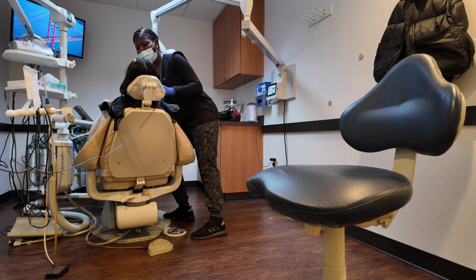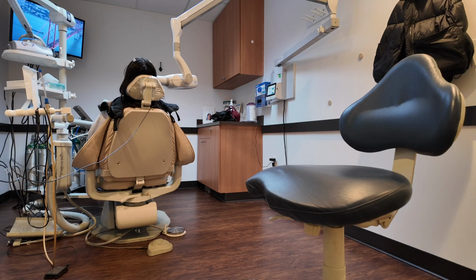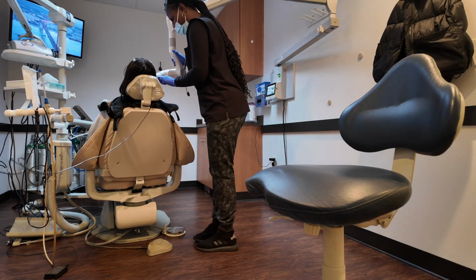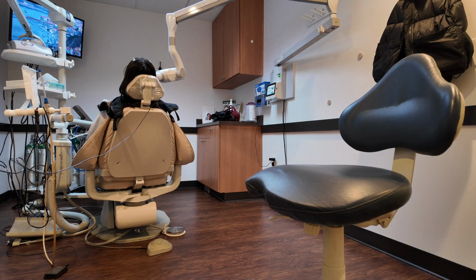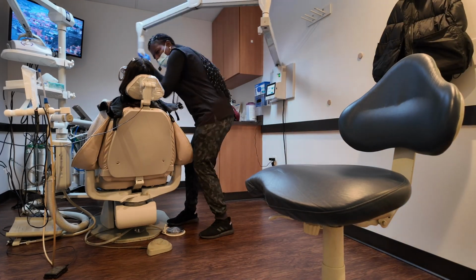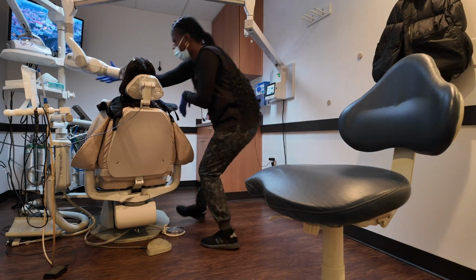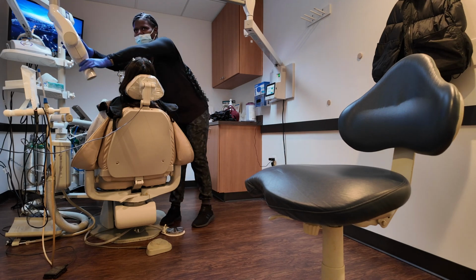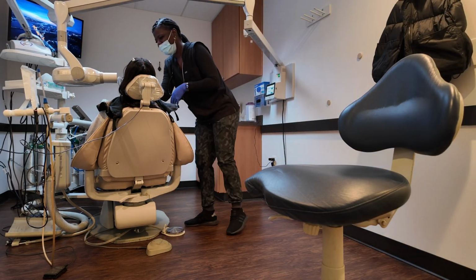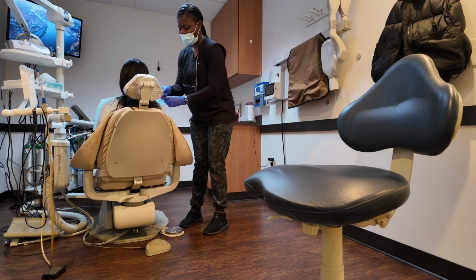Okay, so in this clip, you'll see that I am taking some x-rays on my patient. Today, they just needed some checkup x-rays, and so I am taking 4 bite wings. The series is 4 x-rays, 2 on each side of the mouth, showing the teeth biting down in an x-ray. That way we can see both the top and bottom rows of teeth on x-rays. These are excellent for checking to see if patients have cavities in between their teeth, to see how their teeth are coming together, etc. So this is me grabbing those x-rays before we go ahead and get started.